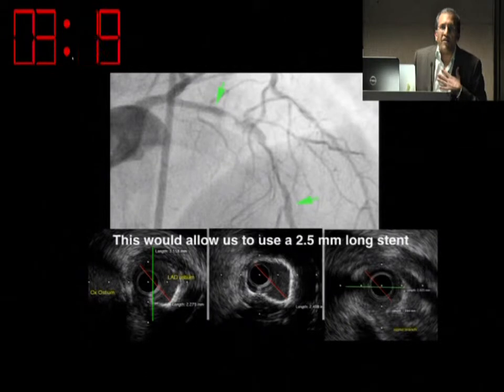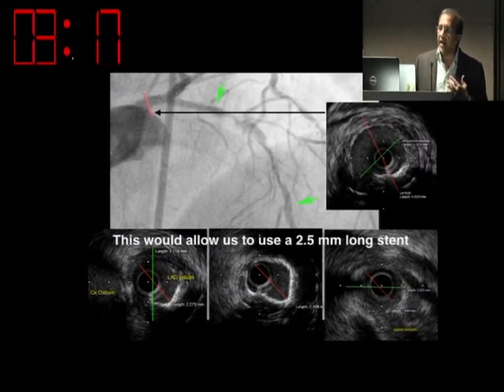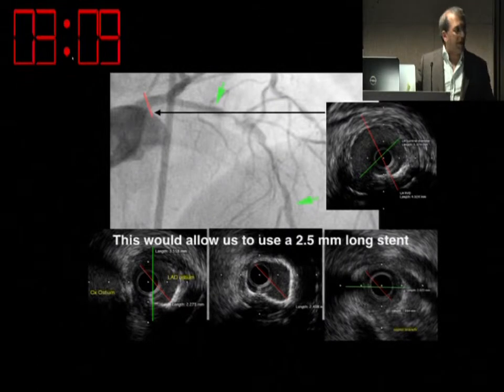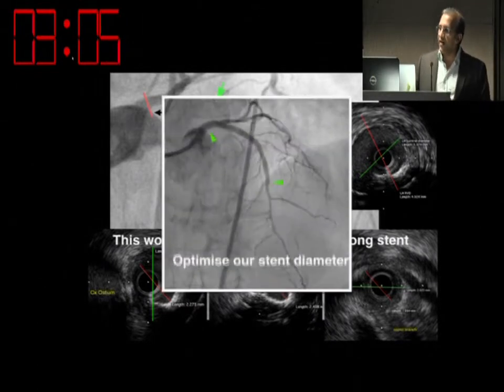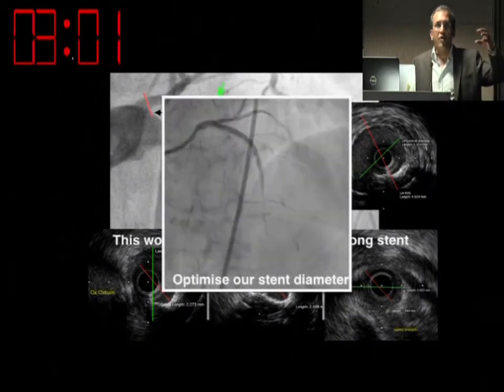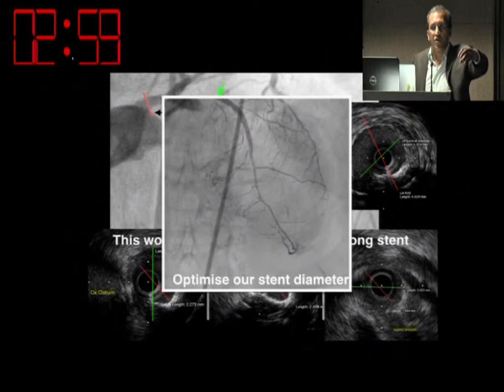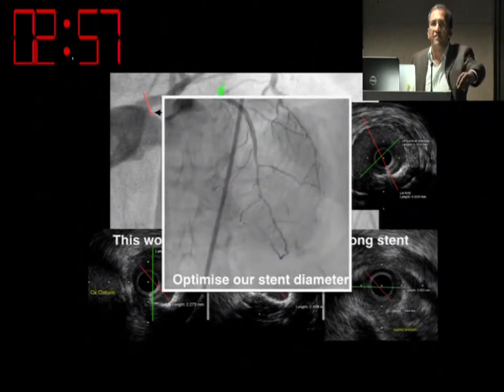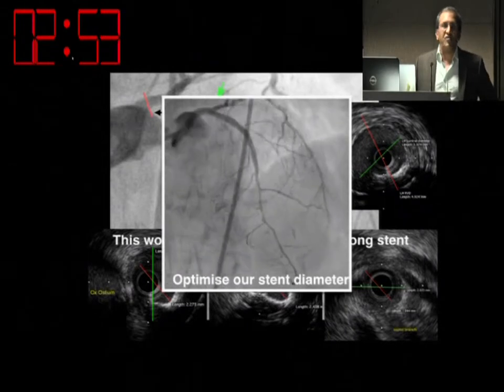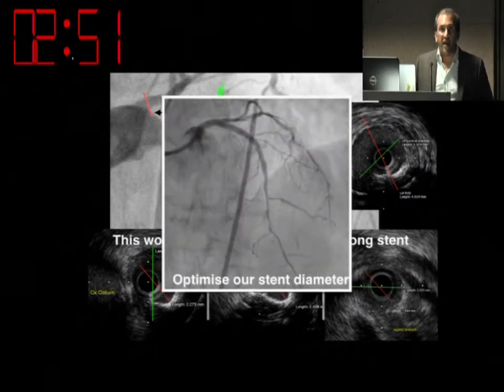How do I look at the coronary artery with IVUS? I go forward and I say, where is a landing zone proximally less than 50%? It's right at the left main. And therefore, instead of stopping short in the proximal LAD, in this particular patient, I would go ahead and stent all the way into the left main and give her a 4-0 artery going into a 3.5, going into the 3-0, and landing into a 2.5. This patient is now 15 months out. She has no angina, her stress thallium is negative, and she's okay.